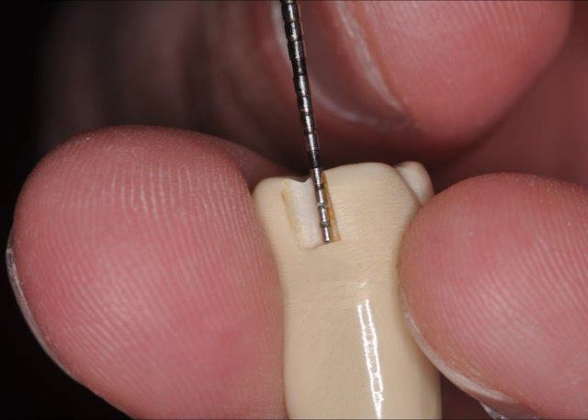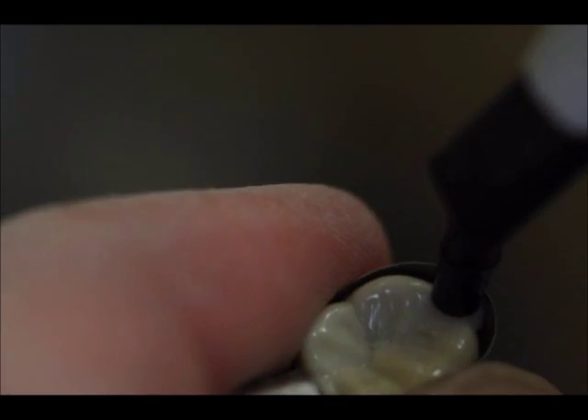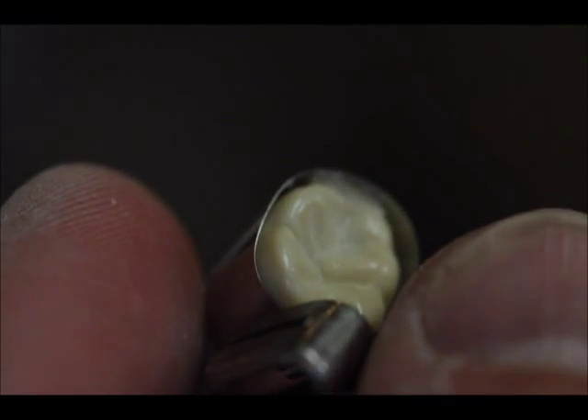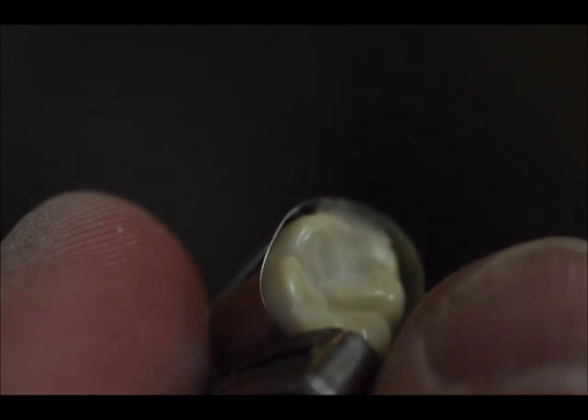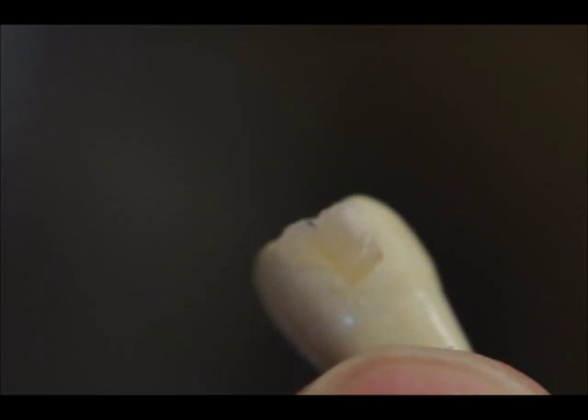I cut some preps about four millimeters deep. You can see this is a matrix band that's not fitting very exactly, but for our purposes it'll do fine. I put some composite resin in there and then I cured it. What this is going to show us is the depth of cure — can we use this material as a bulk fill, meaning just fill up the slot and blast it with the curing light and expect to penetrate all the way down the depth of the box.